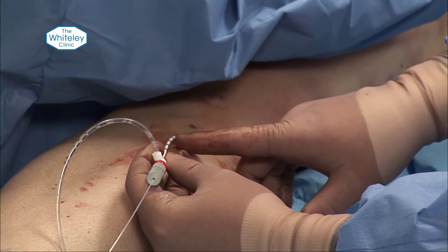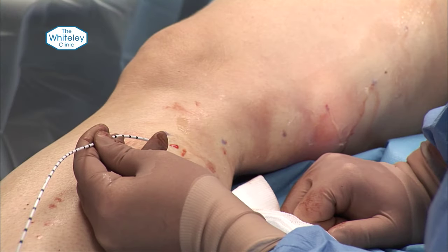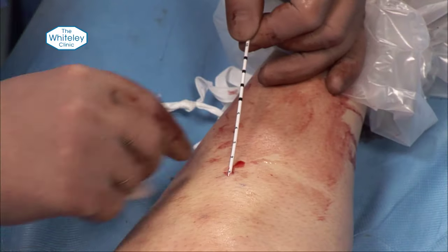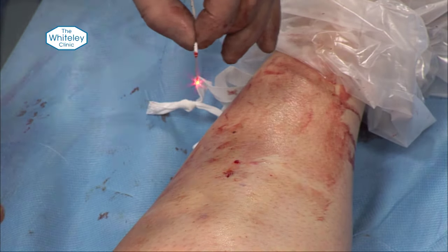So that's 50, 49, 48, 47 — it's 47cm within the patient. And again we're stopping one centimetre short because we know we only got into the vein at the end of the cannula.